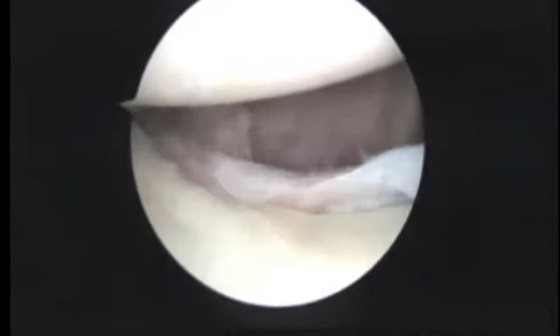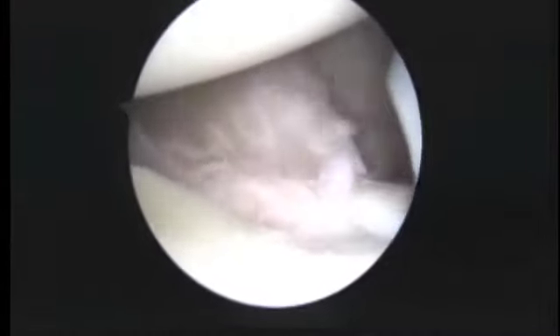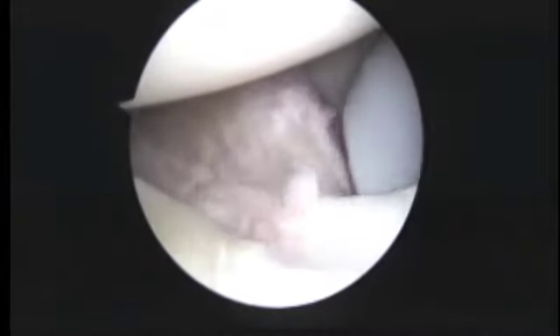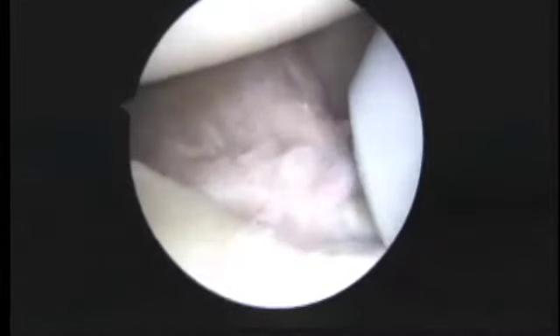As we look down the front, we can see this area that we're going to have to stabilize and reconstruct. The shoulder is very loose, which is what we expected to find. So we're going to have to reconstruct this anterior part of the shoulder, doing a lot of work right at the tip of that cannula and putting in some anchors down there.